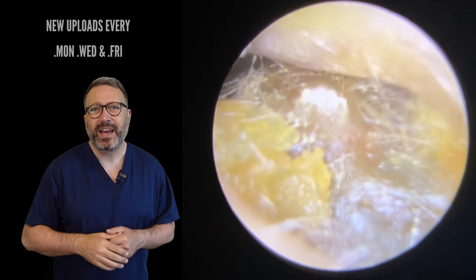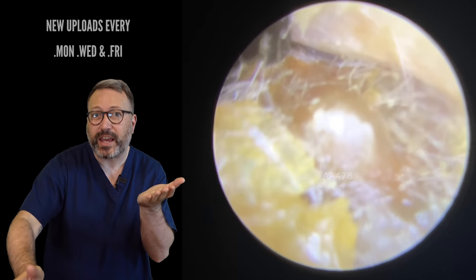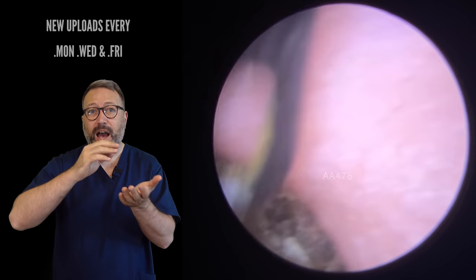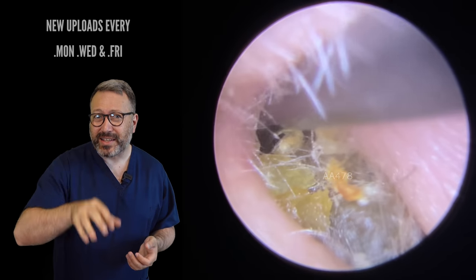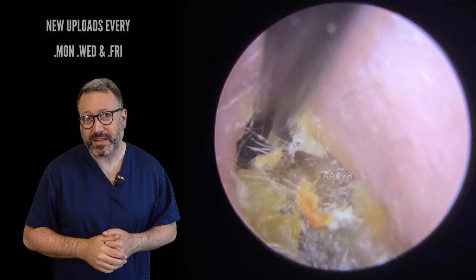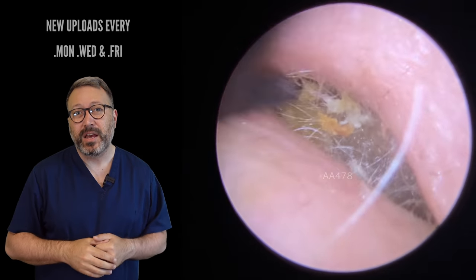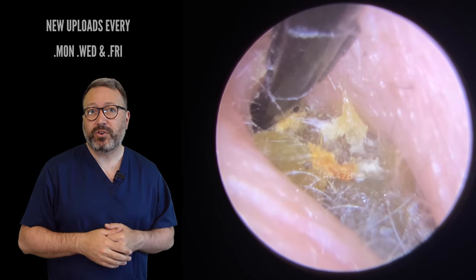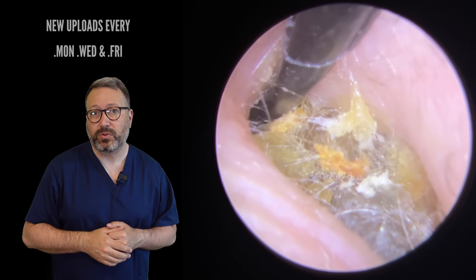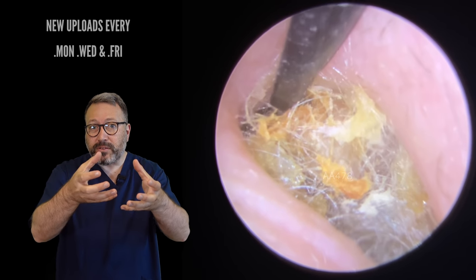On to the patient's other ear now. You can see how tough this is — look how the Jobson horn is just flicking off the top of this wax. I'm having to put quite a bit of pressure on this to get it out, and you can really tell just how hardened up this is. Look how the Jobson horn is actually bending at this point — it is that hard. You can imagine just how uncomfortable this was for the patient. So we've got the St. Bart's hook in here now. We created a little gap with the Jobson horn, so hopefully if it's that tough it'll pull out in one piece.